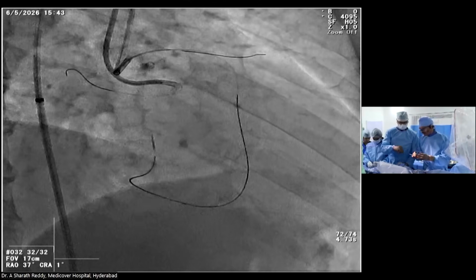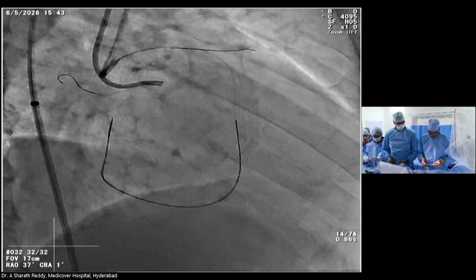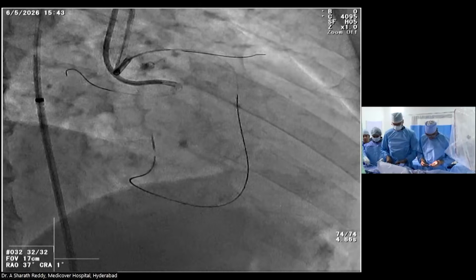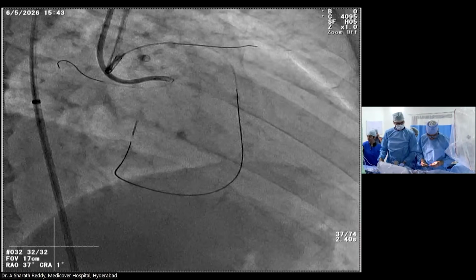Do you even want to go to CP20? Yeah, CP20. It's called Astato outside of Japan, but in Japan it's Conquest Pro 820. The same wire, essentially.